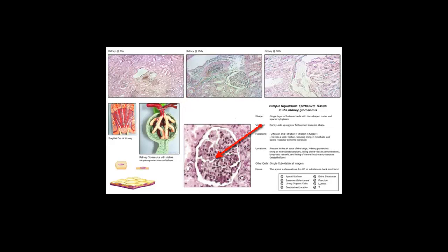This is a good picture that we're looking at of the glomerulus. So this is one of these magnified at full magnification, and we would be looking at the simple squamous cells in a chain all the way around the Bowman's capsule, and that capsule is seen here with its squamous cells as the structure that would receive filtrate as it's filtered through the capillary bed or the glomerulus itself and the endothelial lining that's seen here under hydrostatic pressure.